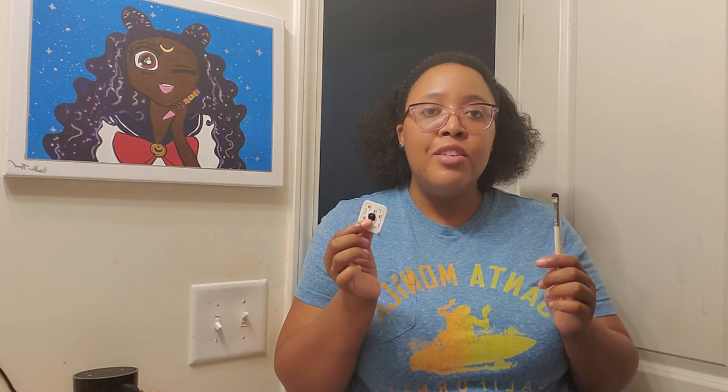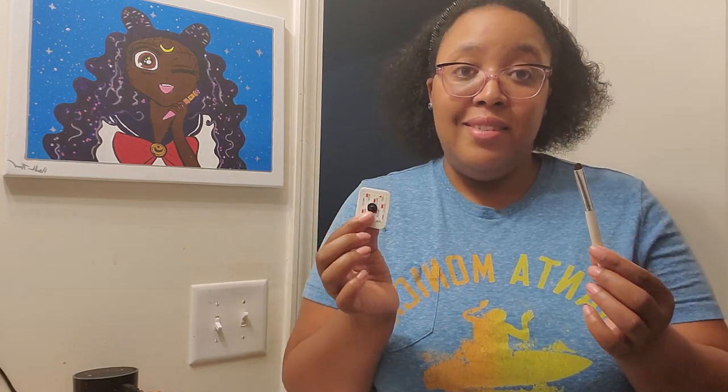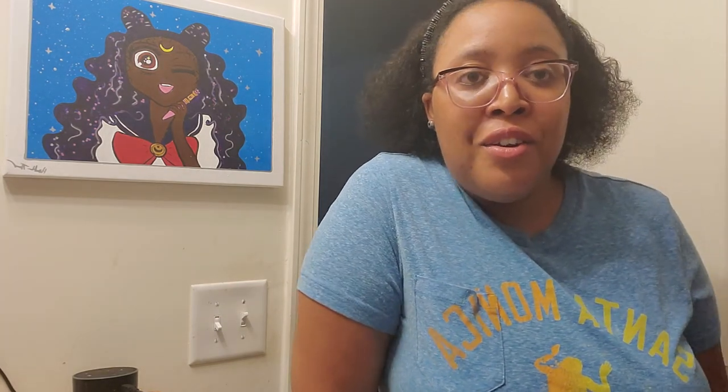And that's really all that you need. I really hope that this helps somebody, because just the thought of ripping your hair out — I have been waxed and it is not fun — and secondly, you just came out of the hospital, you really don't need that on your plate. Please do this, it's easier. I hope that whoever you are watching this for — yourself, a spouse — I hope you feel better. I also want to quickly say thank you to the nurses and the doctors. I understand why he wasn't shaved; they're super busy and super selfless and they took really great care of my husband. Thank you to all the healthcare workers and I hope you have an awesome day.